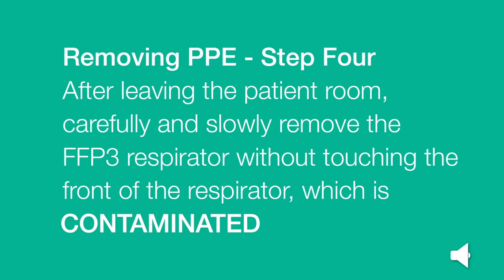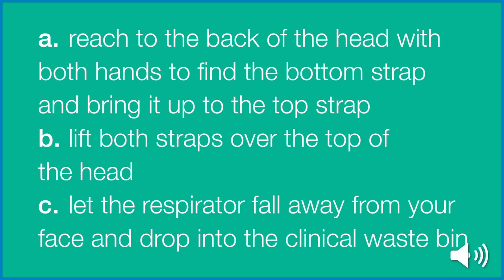Remove PPE Step 4. After leaving the patient room, carefully and slowly remove the FFP3 respirator without touching the front of the respirator, which is contaminated. To do this, reach to the back of the head with both hands to find the bottom strap and bring it up to the top strap. Then lift both straps over the top of the head. Let the respirator fall away from your face and drop into the clinical waste bin.